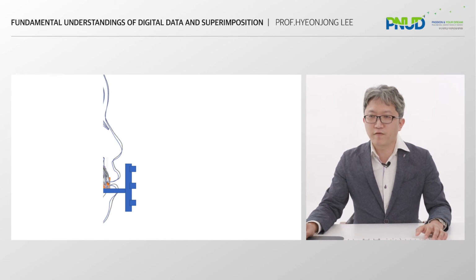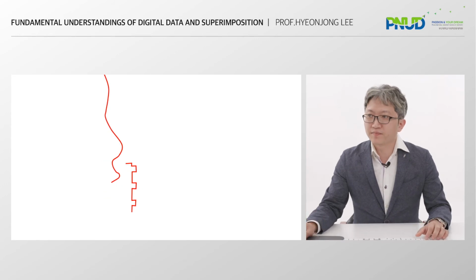When we perform the facial scan, we scan the facial surface including this jig, some structure like this. This is the frame, and we need the same identical surface.